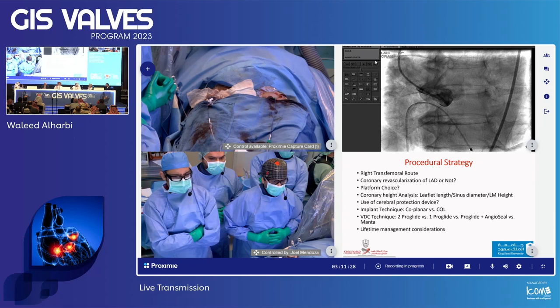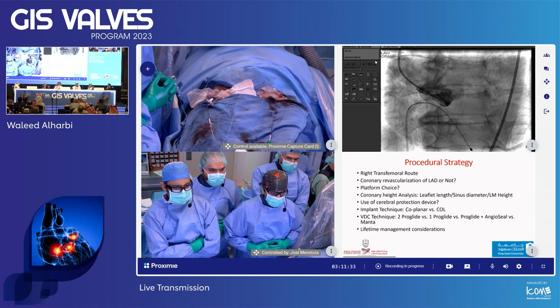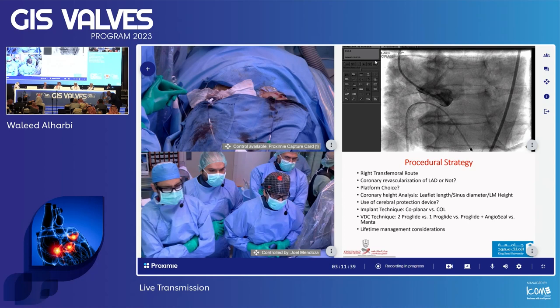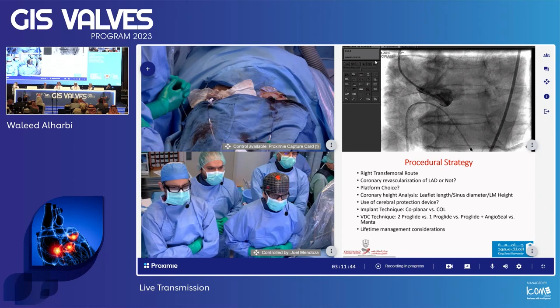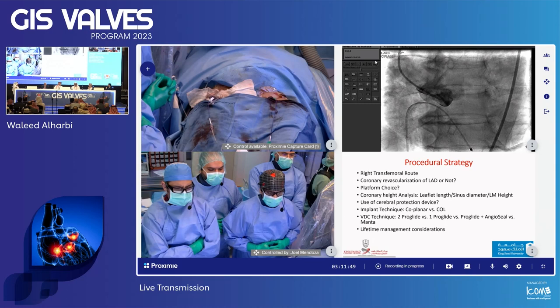The patient presented with shortness of breath and no angina. Regarding implant technique — Dr. Adil Kendi, coplanar or cusp overlap? It depends on the device. With balloon expandable, I generally use coplanar technique, so I'd do the same here.